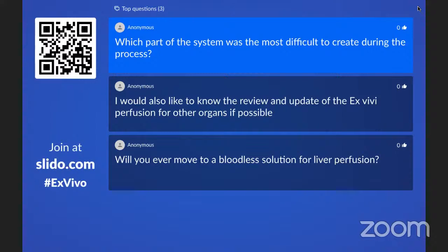I think the hardware is only a portion of the problem. The bigger problem is for me the fluid and the way we perfuse the organ. The kidney and the liver are not stupid. They will figure out, we're not in the body, what I get here is not actually the right fluid, and there's even some plastic involved. So tricking the organ into thinking it's in the body requires a very detailed understanding of how the fluid has to be created, how the flow has to be done, what temperature it needs.